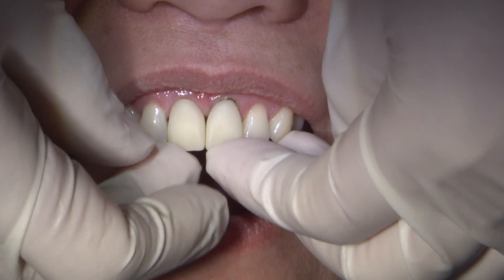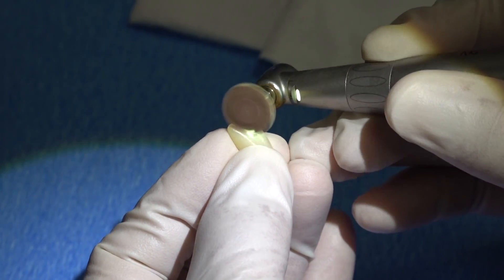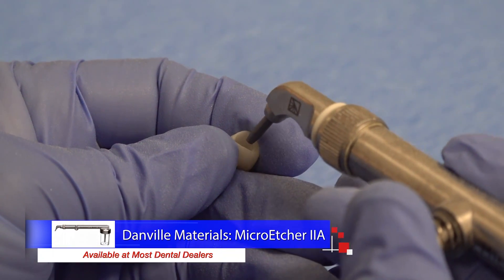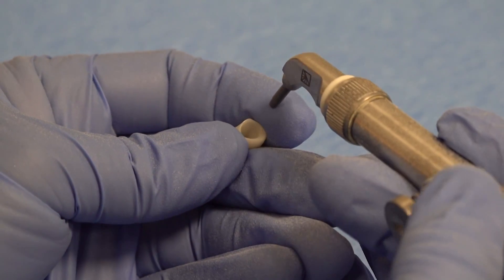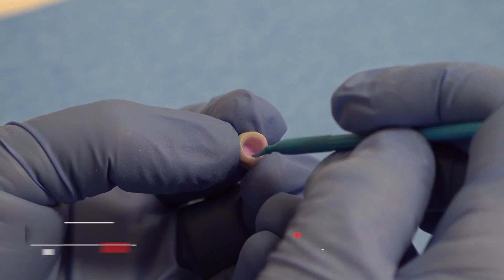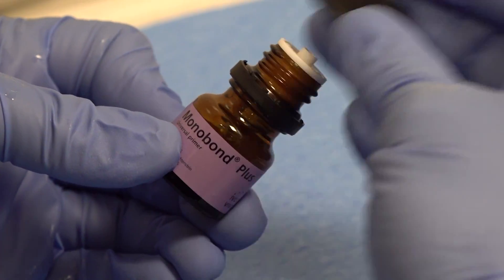After a quick try-in to check the fit and contacts, I continue polishing with the polishing wheels from the Bruxer adjustment and polishing kit — the brown disc polisher to pre-polish and remove fine surface scratches, then the blue disc for a nice high shine. Since I'm planning to bond these restorations in, we air-abraid the intaglio with 50 micron aluminum oxide using a Danville chair-side micro etcher. This creates a rough internal surface to improve the bond and removes any salivary contaminants from the try-in. An alternative to air abrasion for lab restorations are special zirconia cleaners such as Ivoclar's Ivoclean — place a drop inside, scrub for 20 seconds, rinse and dry, and you have a clean surface to bond to.